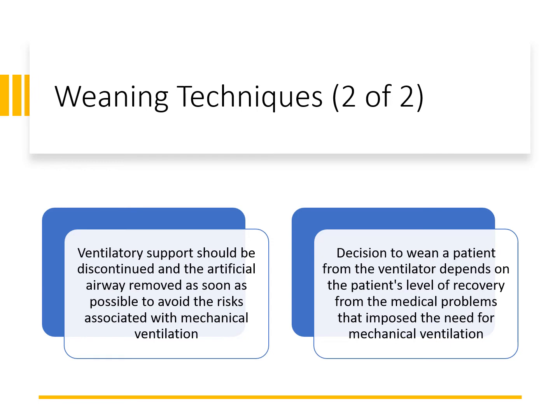So we're going to look at a lot of different techniques used during weaning, and we're going to look at a lot of evidence-based recommendations and seeing if they meet requirements for discontinuation. But as always, the big thing is the discussion in the care team about the clinical condition of this patient, what's their ability to wean, and then maybe in some patients we do a long-term care approach if they can't be weaned from the ventilation sooner than later.